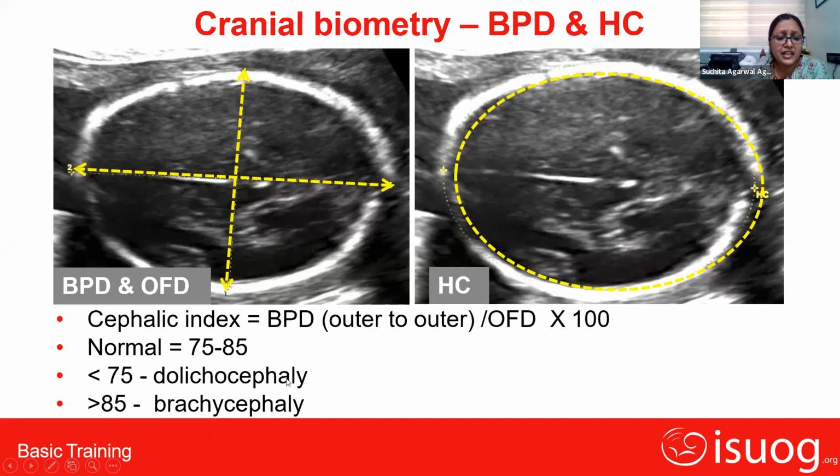This dolichocephalic head, if the baby is in breech presentation, most of the cases when the baby is in breech presentation, we may get a dolichocephalic head. So that does not mean that it is an abnormal baby.